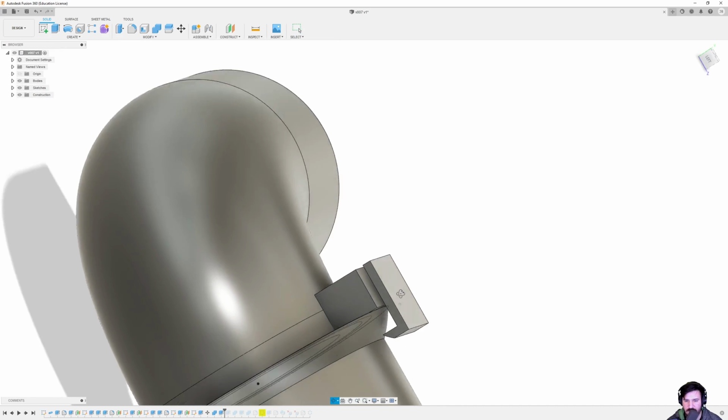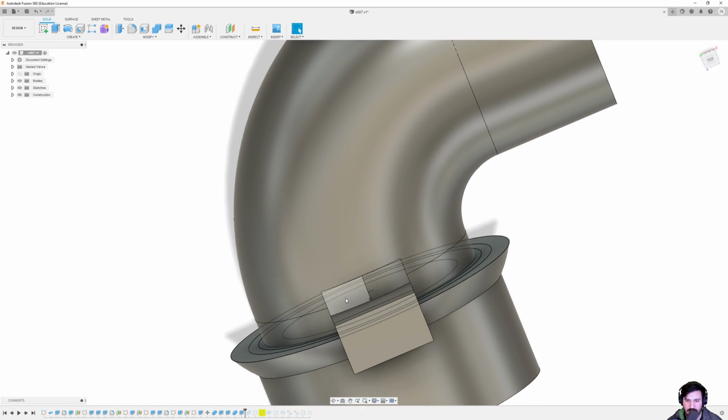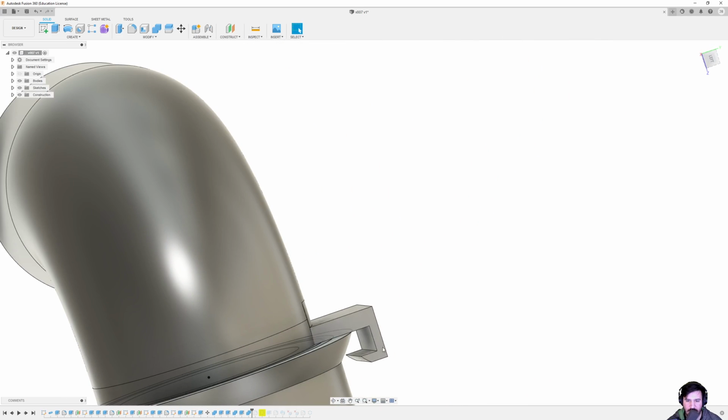I trimmed this top down a little bit so it is not as thick. You can see there, just to make it a little bit thinner, maybe flex a little bit more. I connected the two. I joined those two together, and then I think I joined those. No, I trimmed it off. And so, yeah, you can see these plates now like that. I'm getting those. I believe I tried to get rid of them in the future, but before that, I connected all these together. If I go back, I made them all one piece.